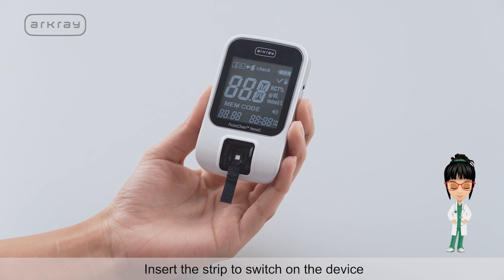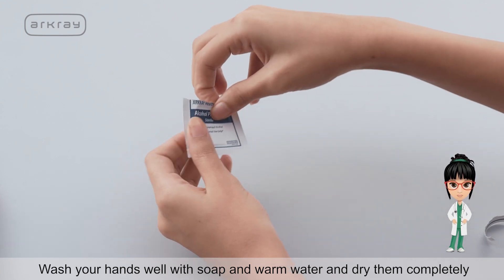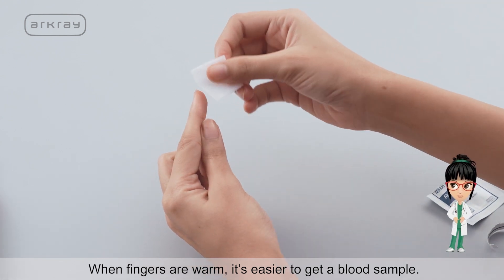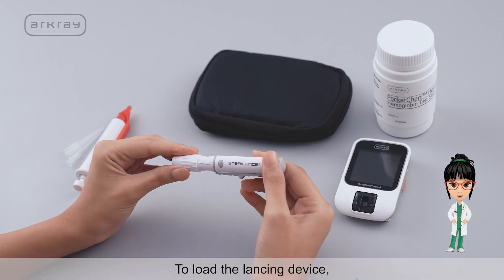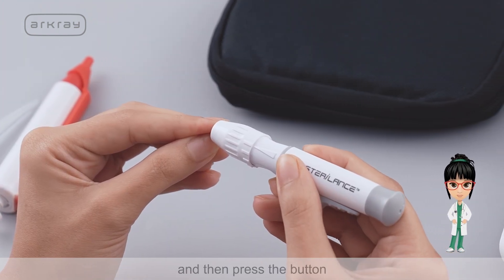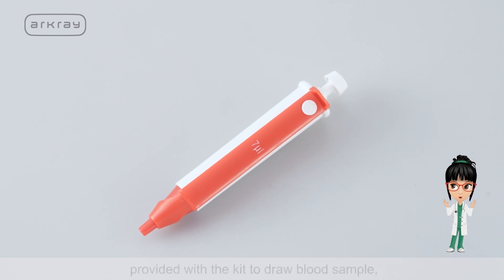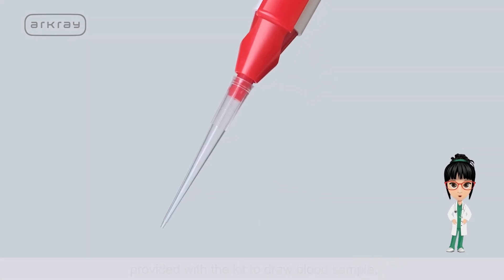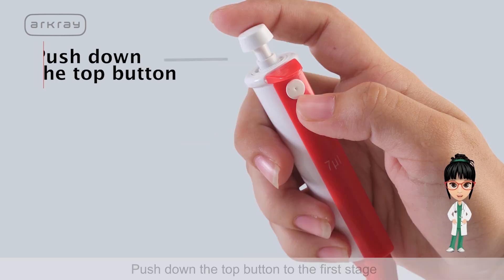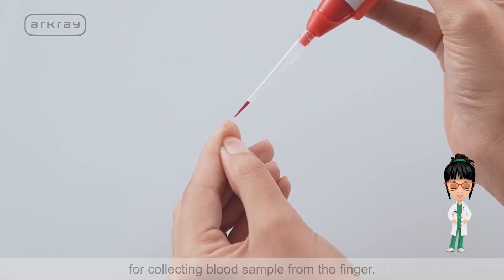Insert the strip to switch on the device. Wash your hands well with soap and warm water and dry them completely — when fingers are warm, it's easier to get a blood sample. To load the lancing device, pull back the end, position it at the tip of your finger, and press the button. When using the 7 microlitre mini pipette provided with the kit, first insert the pipette tip into the pipette tightly, then push down the top button to the first stage for collecting the blood sample from the finger.